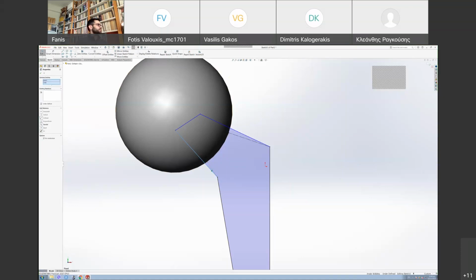Okay, so now I have a closed shape. I'm gonna make this collinear. I'm also gonna make this collinear. So now I don't really care about that because we're gonna trim it afterwards because it interferes with the sphere. But for the moment, let's just give it a dimension so it's not poorly defined, you know. We can say, for example, it's 5. Okay, and you need to give it an angle as well for some reason. Okay, so it doesn't matter. These dimensions don't matter. You will see now why.